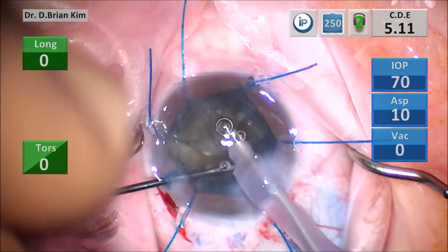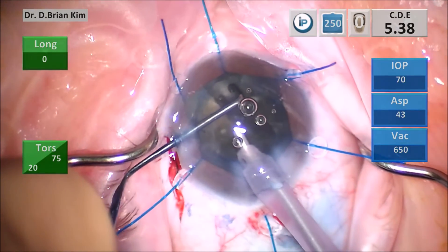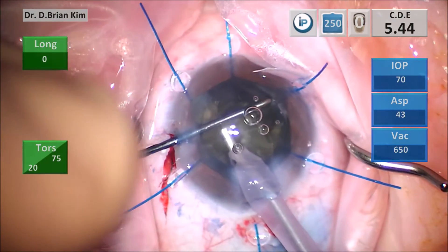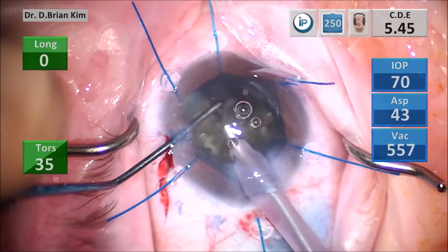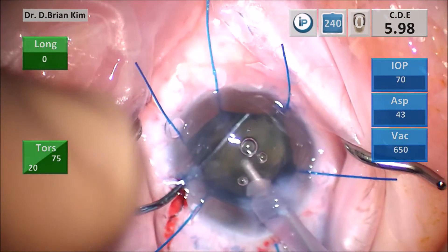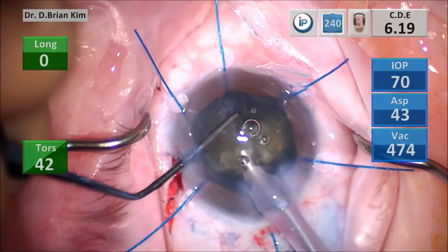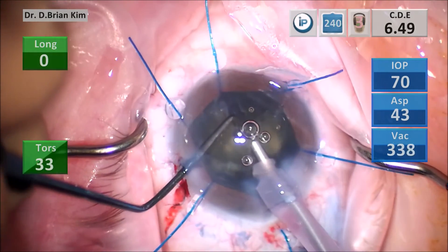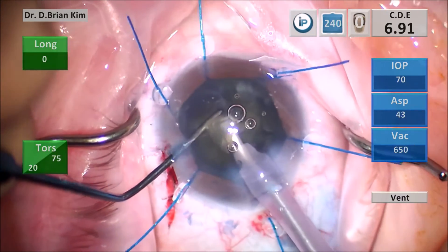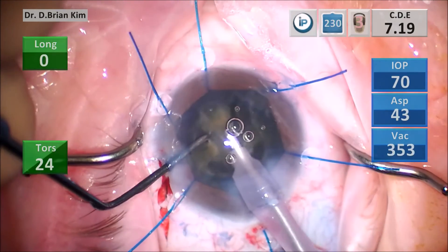I place the chopper out to the equator and bring the fragment to the central safe zone without fishing for pieces peripherally. You can see the density of this lens as I chop — you can feel a sudden loss of resistance as I squeeze the two instruments together, which shows how dense this lens is. I'm using very gentle application of ultrasound and vacuum, and as a result the bubbles remain captured within the dispersive viscoelastic coating the endothelium.